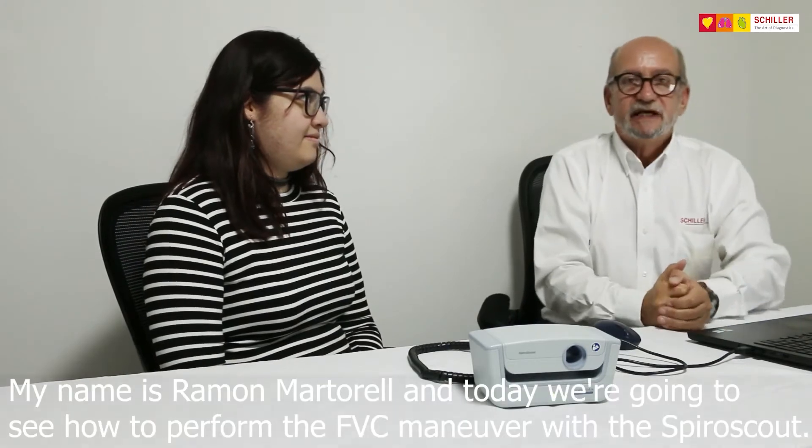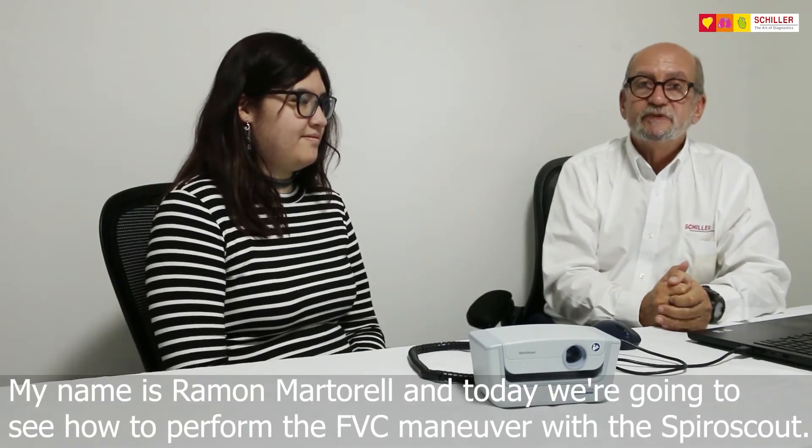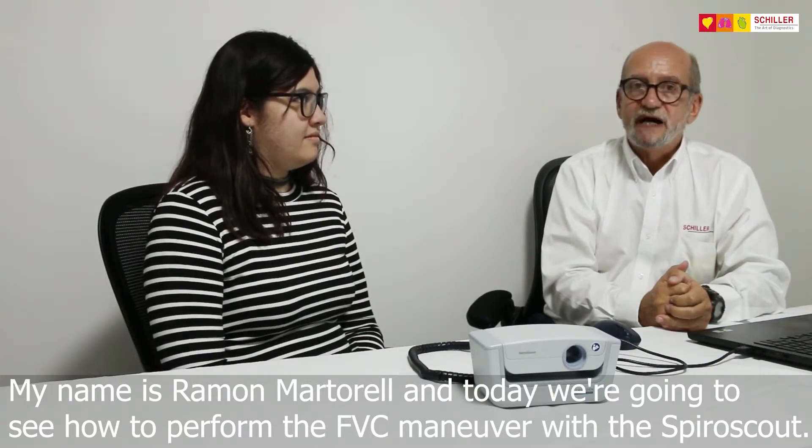Hello, my name is Ramon Martorell and today we are going to see how to perform an FVC maneuver with the SpiroScout.